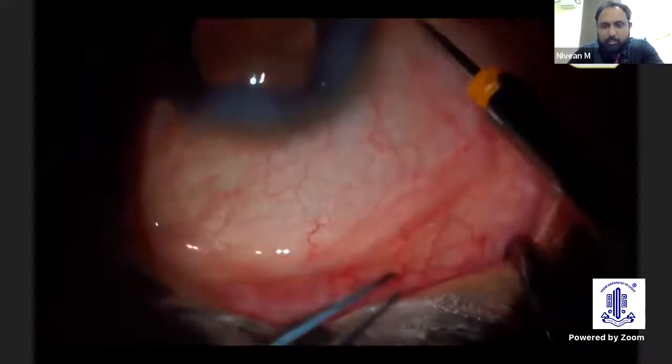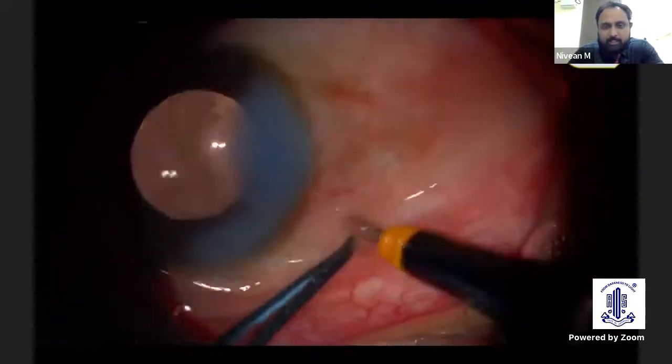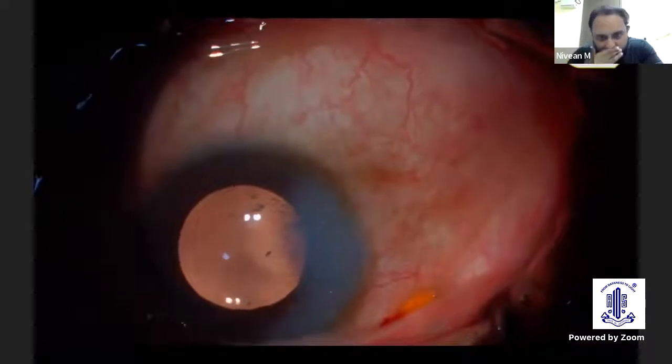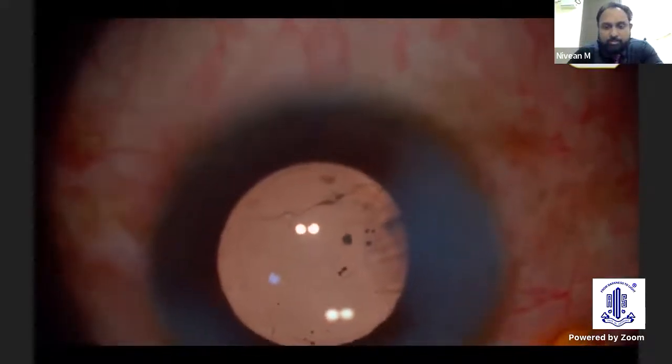Here again, I don't know, most of the anterior segment surgeons are using the 23 gauge assisted vitrectomy in case they have a posterior capsular rupture. Nowadays, the new concept is that the pars plana management of PCR is definitely better than the anterior approach.